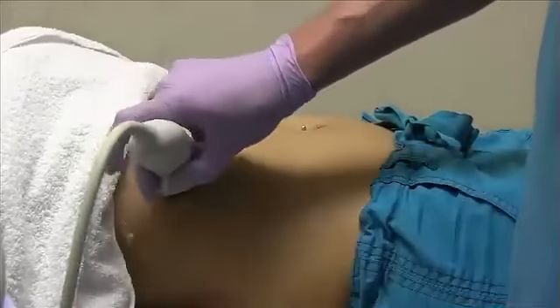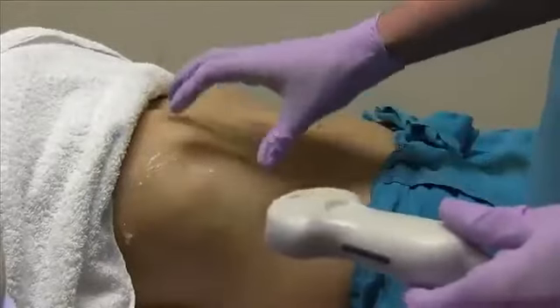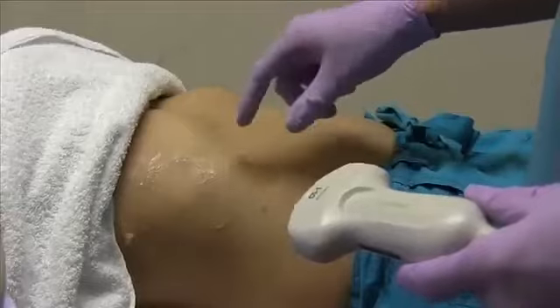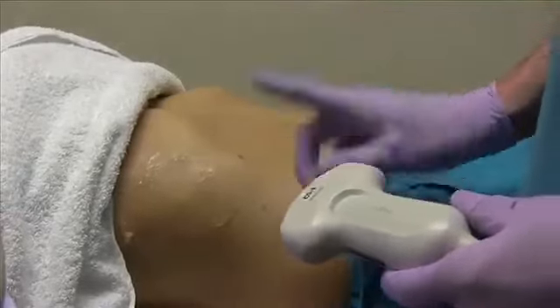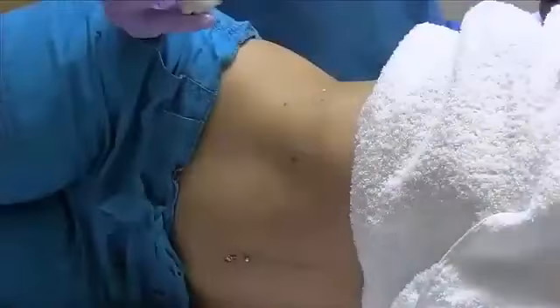For the gallbladder, we also get decubitus pictures just to make sure there are no stones trapped in the fundus or the neck of the gallbladder. So for that, I'm going to have you turn onto your left side away from us. For this, the gallbladder usually moves a little bit forward.